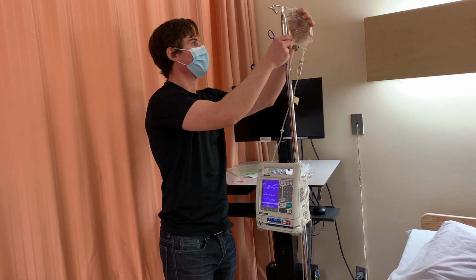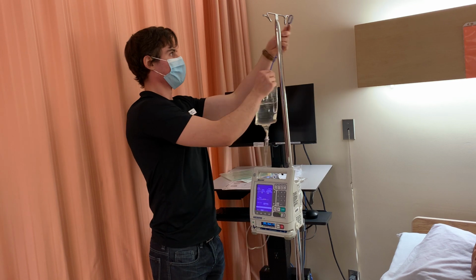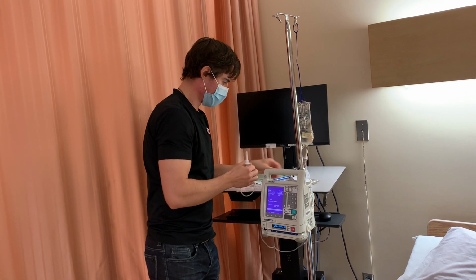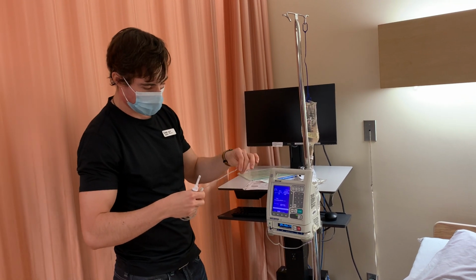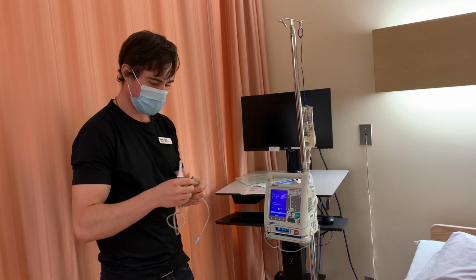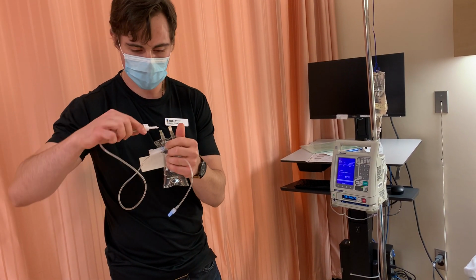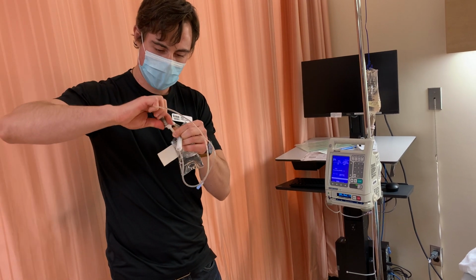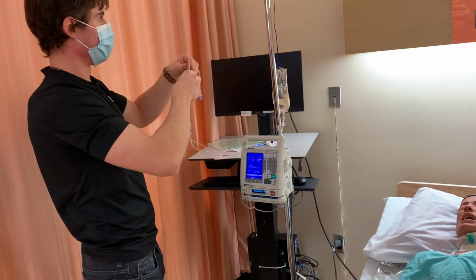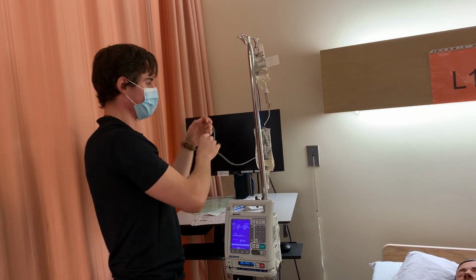So now I'm going to set up my pump. So we're going to start by putting this slightly lower. Then I'm going to make sure that my roller clamp is clamped. I'm maintaining sterility. Spike our bag and hang that above.